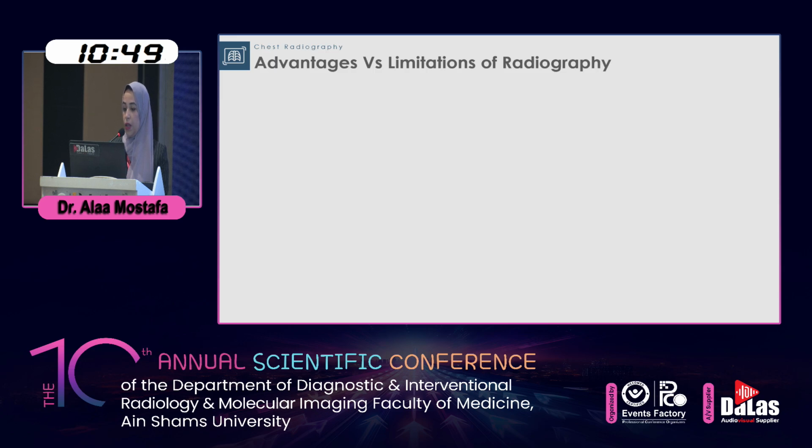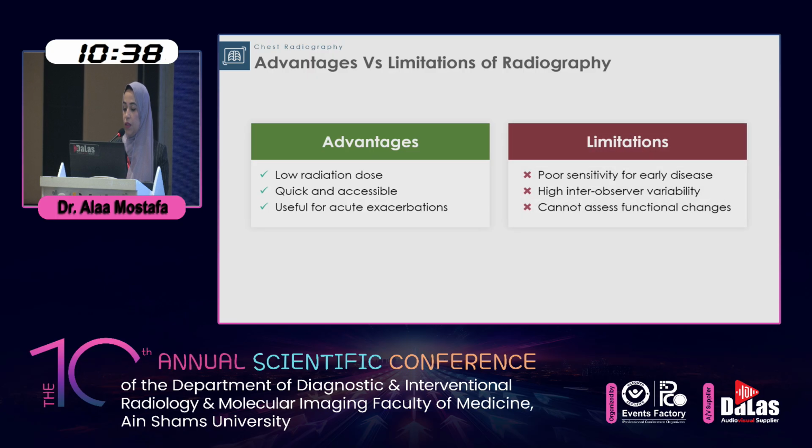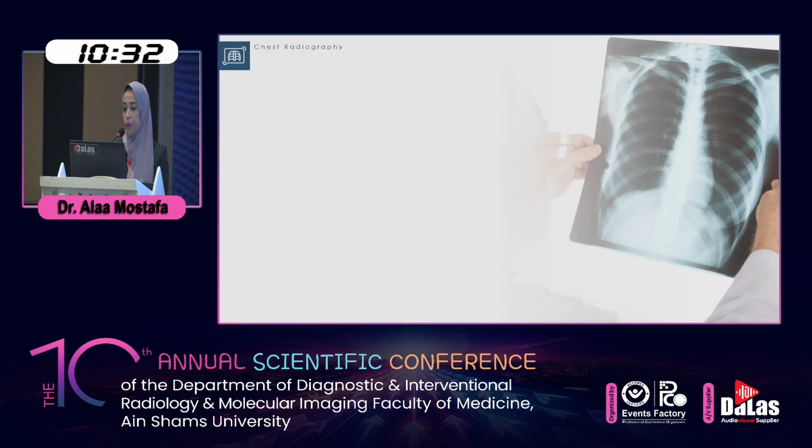Advantages versus limitations of radiography. Radiography is quick, inexpensive, and low in radiation. It's ideal for frequent monitoring, especially in resource-limited settings. However, it lacks sensitivity for early disease and has high inter-observer variability. It's best used alongside other modalities.